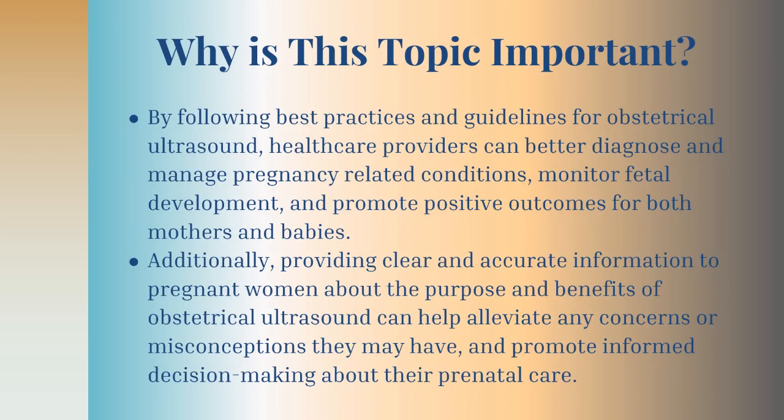By following the best practices and guidelines for obstetrical ultrasound, healthcare providers can better diagnose and manage pregnancy-related conditions, monitor fetal development, and promote positive outcomes for both mothers and babies. Additionally, providing clear and accurate information to pregnant women about the purpose and benefits of obstetrical ultrasound can help alleviate any concerns or misconceptions they may have and promote informed decision-making about their prenatal care.